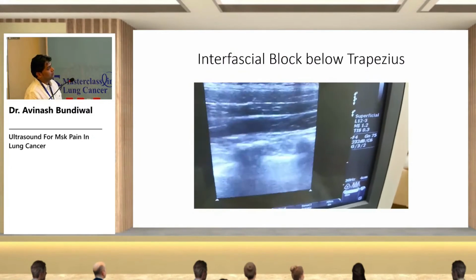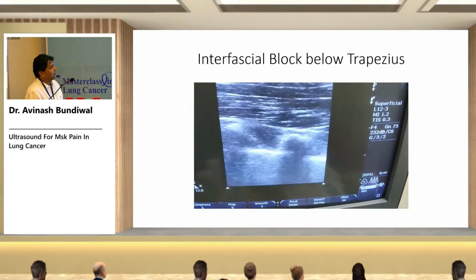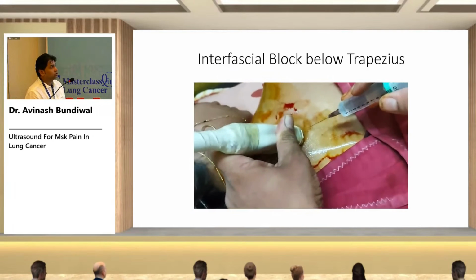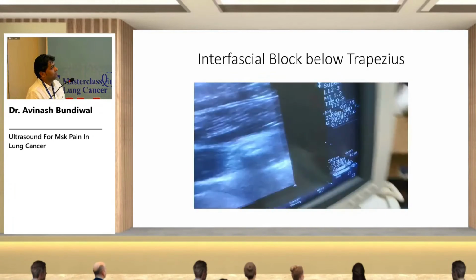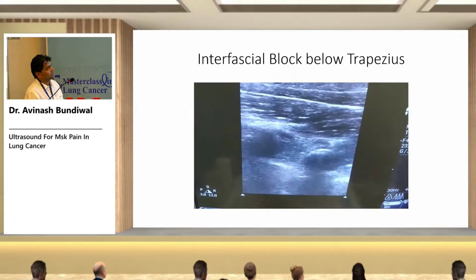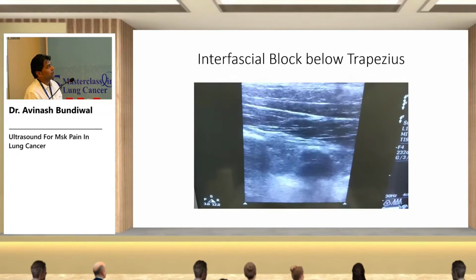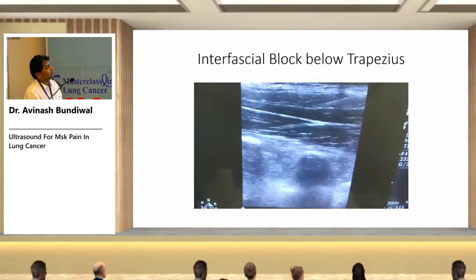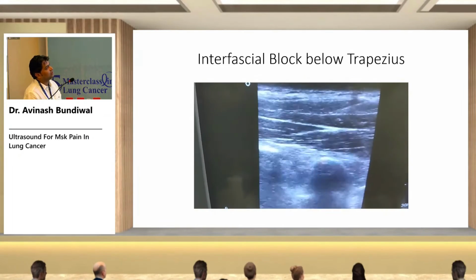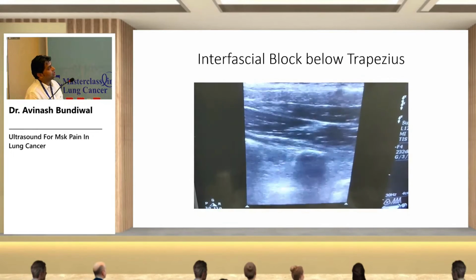This patient was having severe back pain, which even referred to the upper limb. As the MRI was clear, I gave just a myofascial block between the trapezius and erector spinae muscle, and the patient got really good relief, around 50 percent. You can see the needle movement here. This is the needle, this is the trajectory of the needle, and here the drug is spread in the fascia.